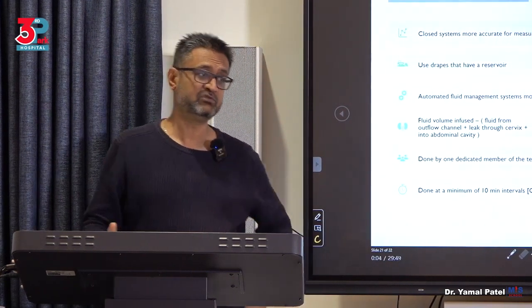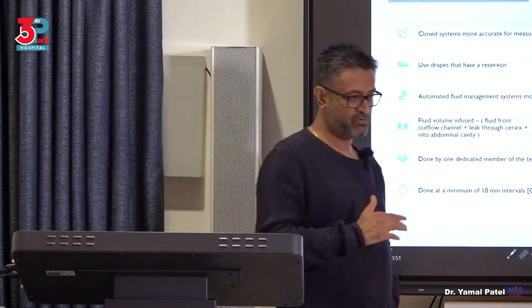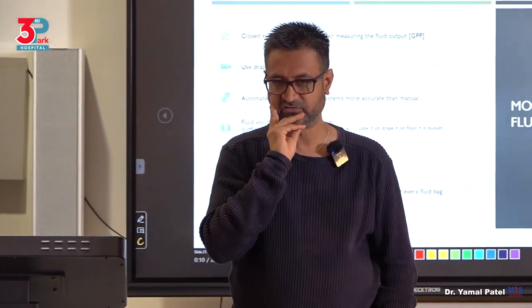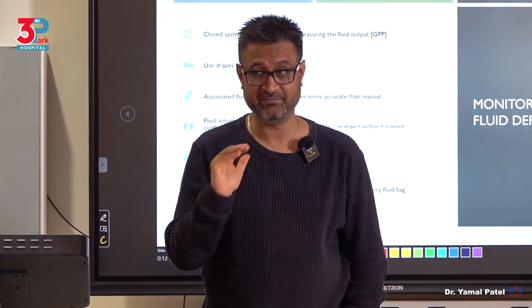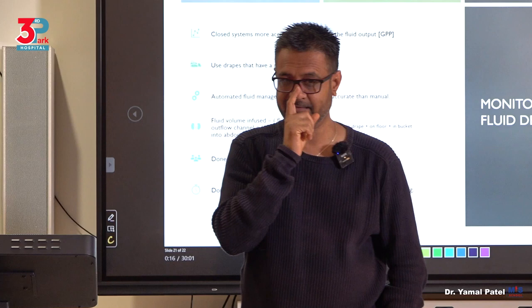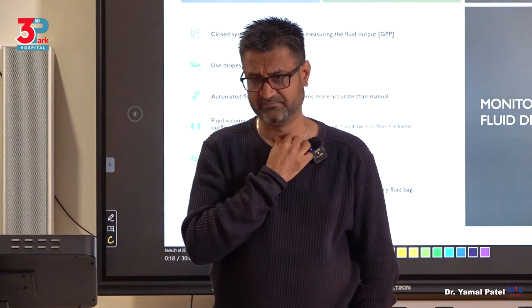Have a good system to manage the fluid in and out. So it means every 10 minutes, a nurse should, in an ideal situation, I'm telling you what is ideal, guys, there's one nurse whom you dedicate in that theater to fluid.